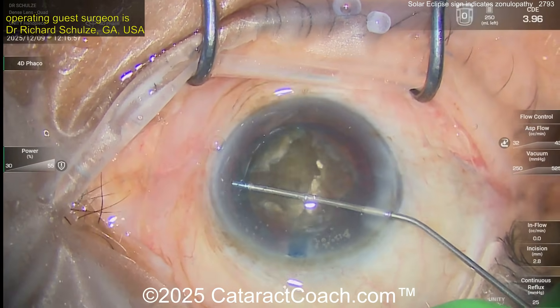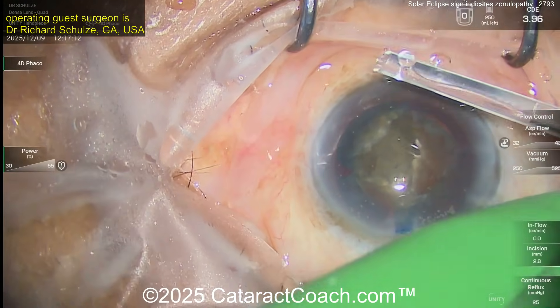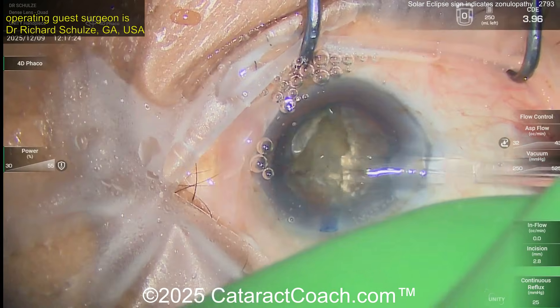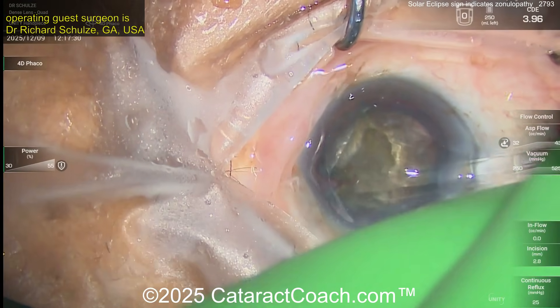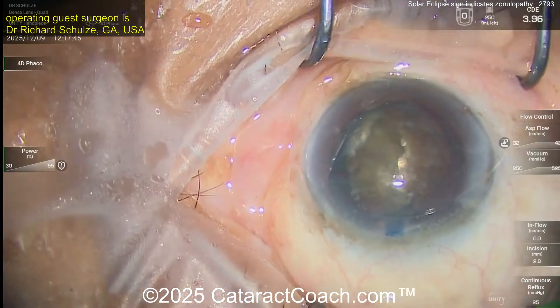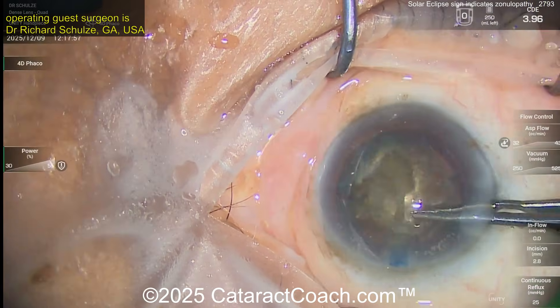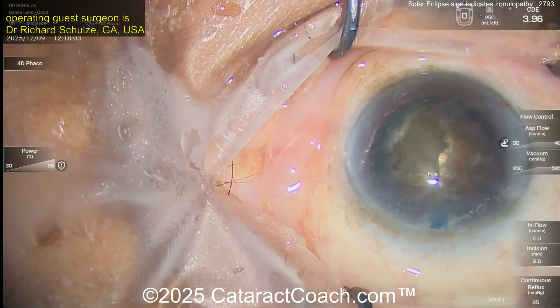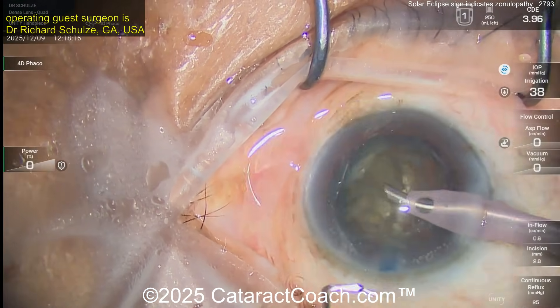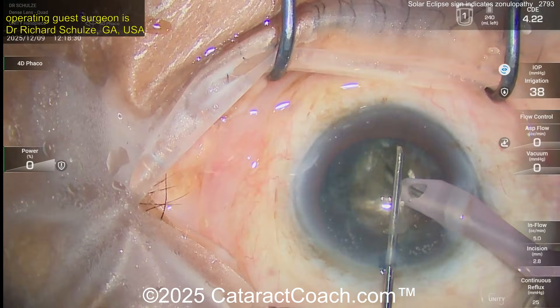Now putting in some viscoelastic in the bag — you probably want to put some support there, like a capsule tension ring (CTR). Here comes the CTR using an injector. Make sure you have enough of a gap with the viscoelastic to allow easy insertion. The CTR is partially in the bag now — get that last end in, and it travels around nicely. That's going to help provide broader support.